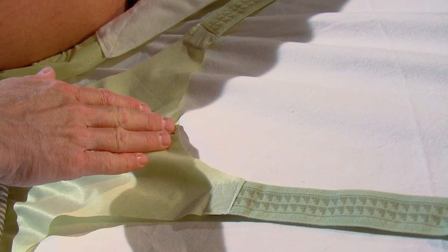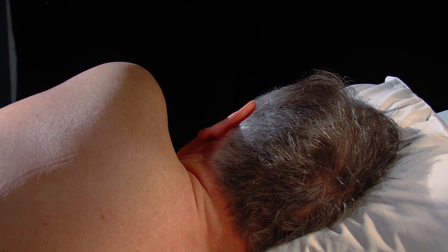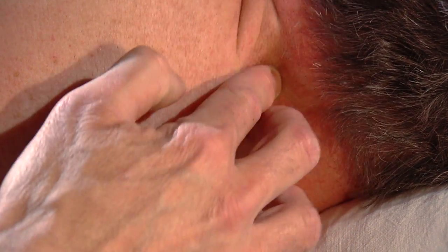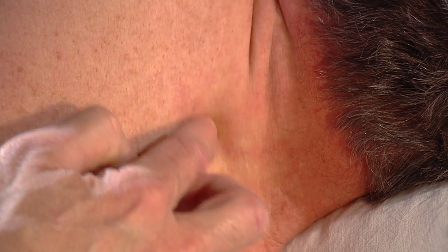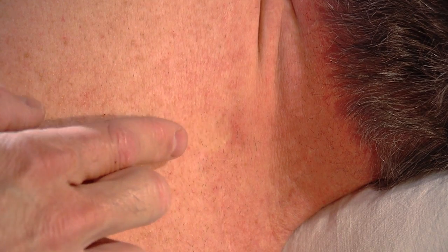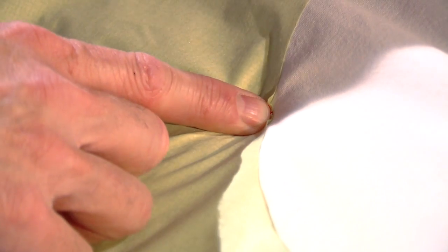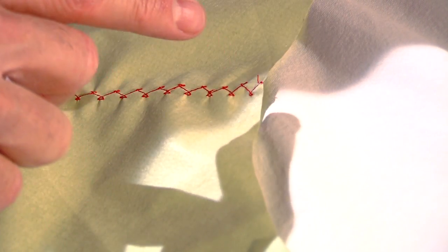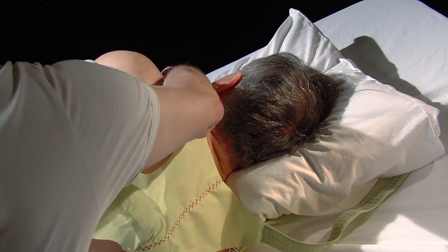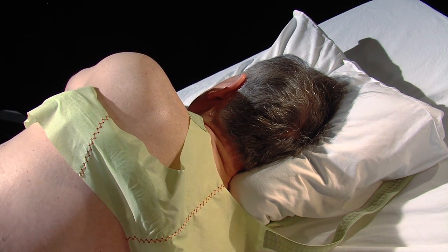Align the upper edge of the sensor belt with both shoulders. Identify the dorsal process of the prominent 7th vertebra, also called C7. The upper end of the midline shall finally reach C7. Lift up the loose flap of the sensor belt. Lay the shoulder strap over the patient's shoulder and rub the foam coated part around the chest just below the armpit.